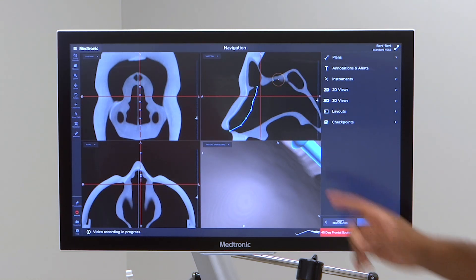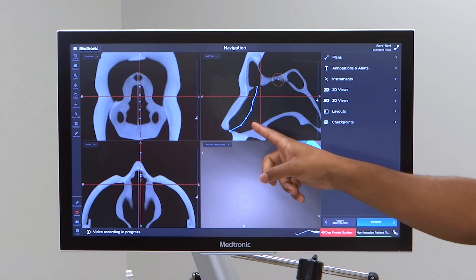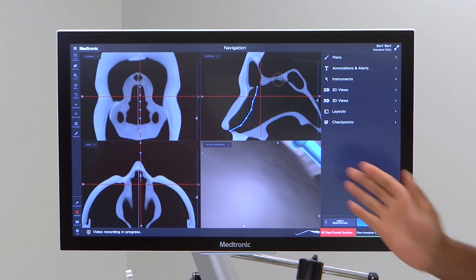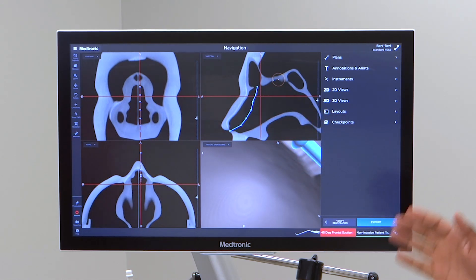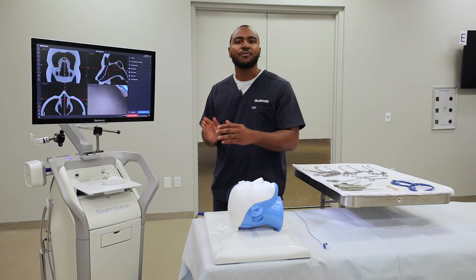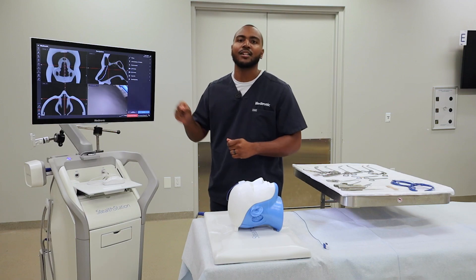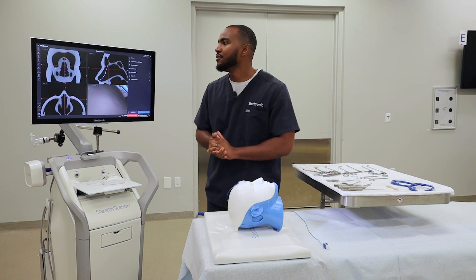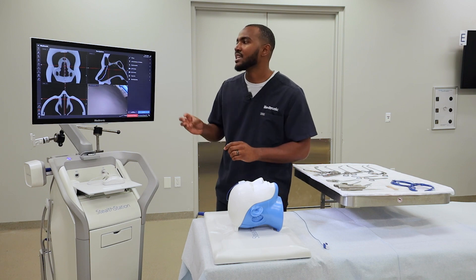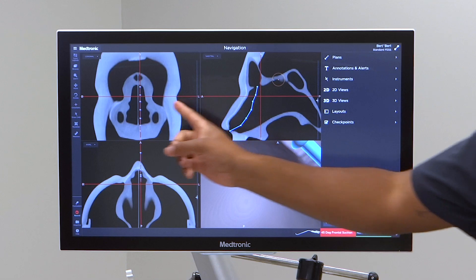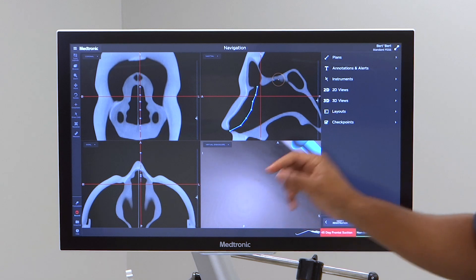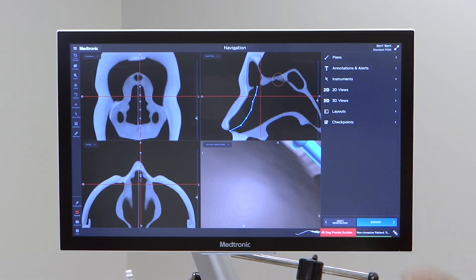One thing I want to point out is I made the non-linear plan on one plane. It'll also work on different slices of the scan as well. If you set the waypoints at different slices and thicknesses, it will still function correctly.